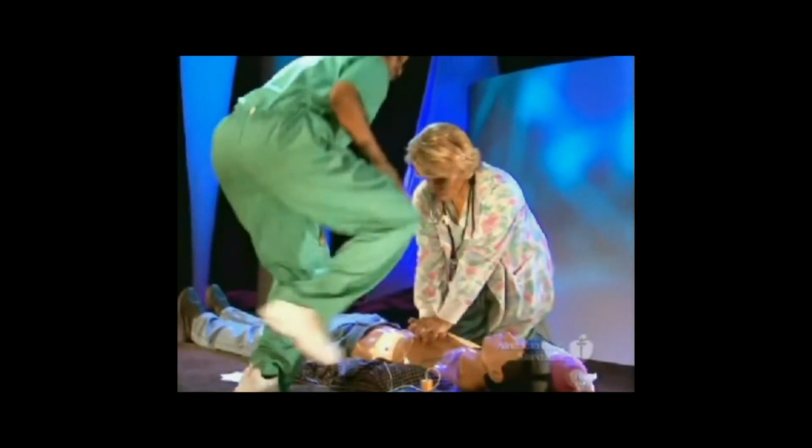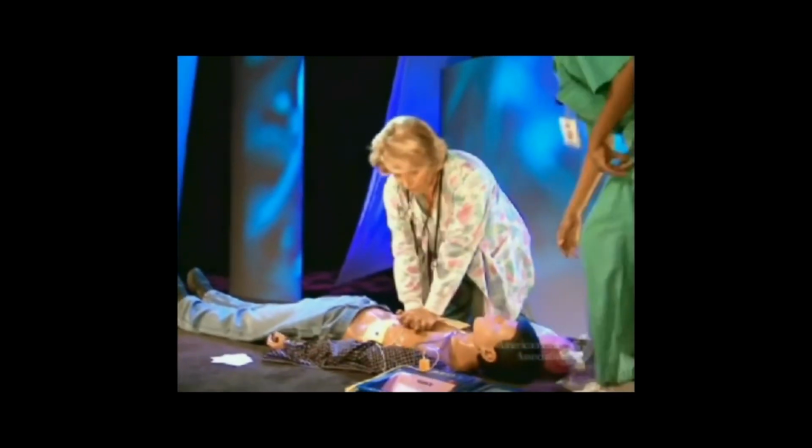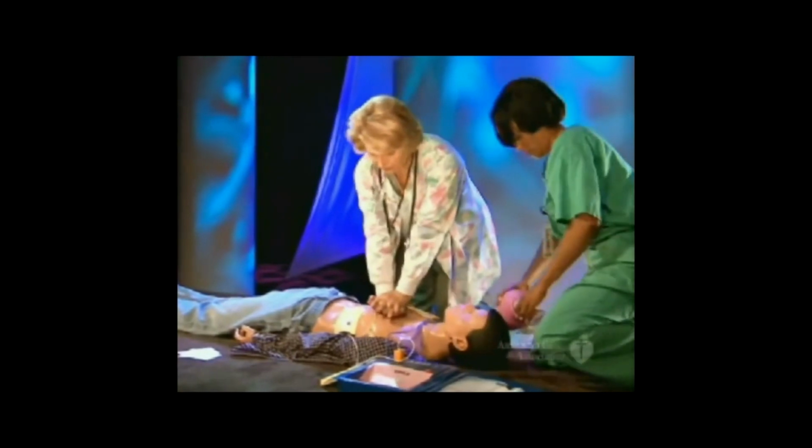Begin CPR. Repeat the sequence of CPR and AED use until advanced life support providers take over or the victim starts to move. So, now you know how to use an AED with 2 rescuer CPR.